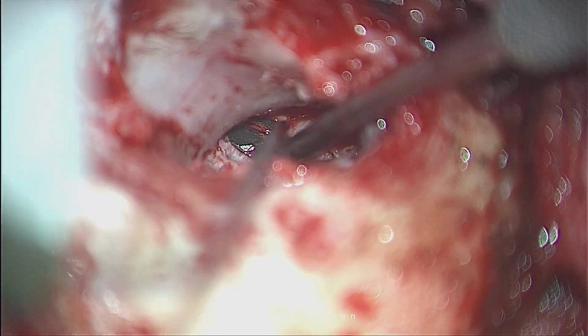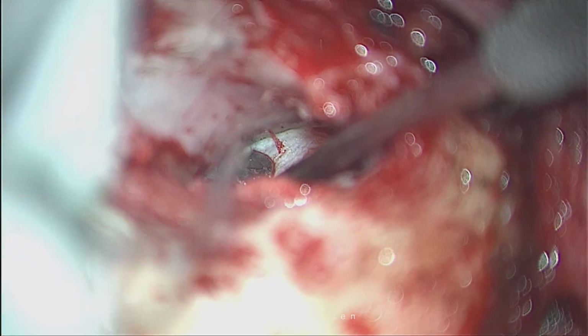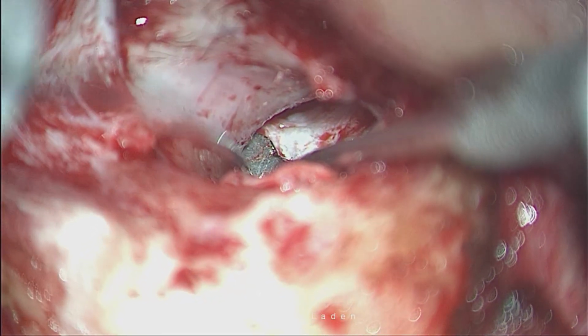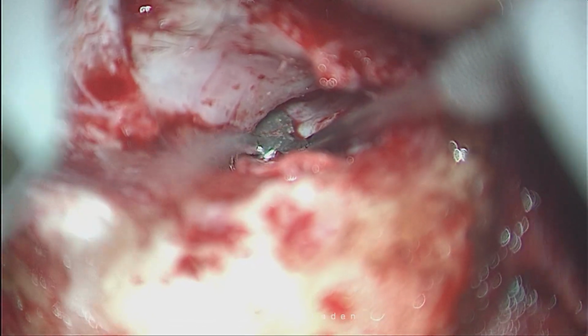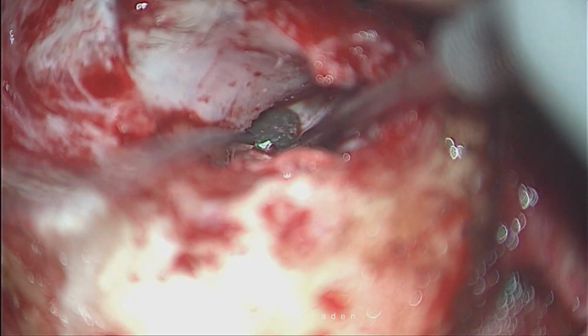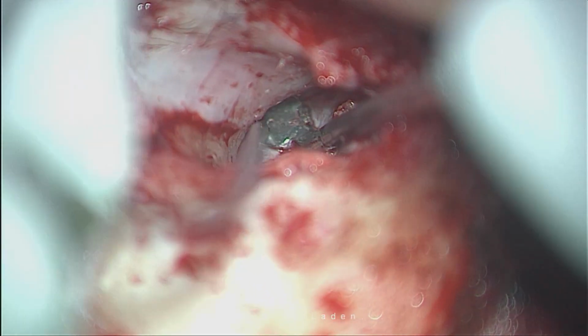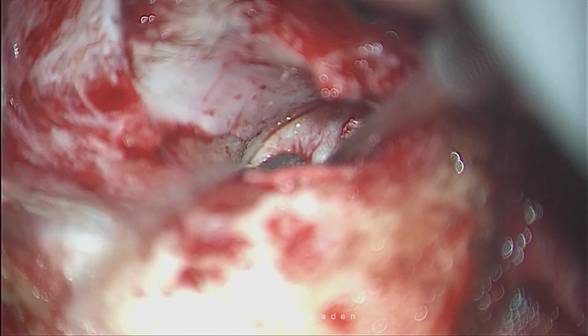We have seen anterosuperiorly, now see anteriorly. See the annulus anteriorly? Now anteroinferiorly. Simple technique. If you execute properly, you can literally give better results in certain situations. See this, the anteroinferior annulus.